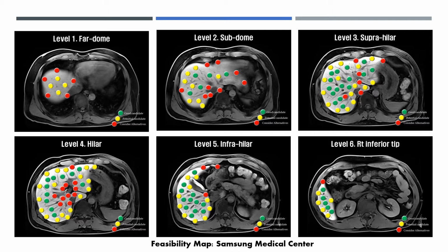I wonder if you agree or not. This is the feasibility map for liver ablation with the consensus of 4 doctors in our center. The green color indicates the best candidate for ablation with no technical problem in most cases. The difficulty of yellow-colored sites is higher than the green-colored sites. If you use advanced techniques, including fusion, CEUS, or artificial ascites, the difficulty could be decreased.